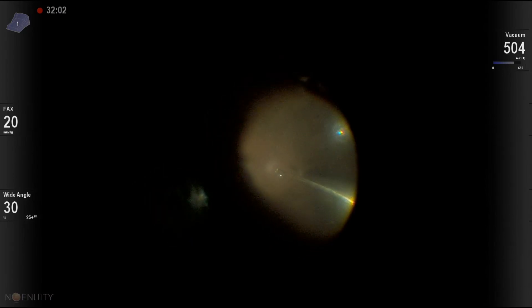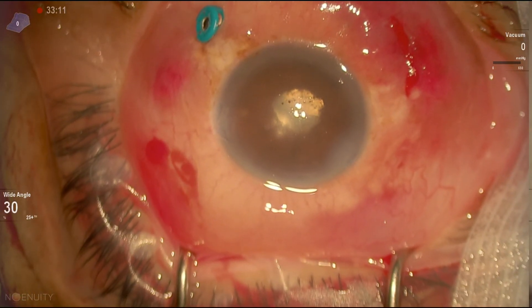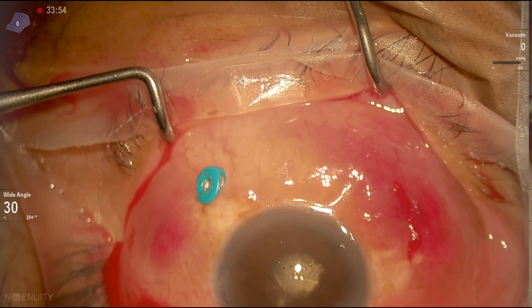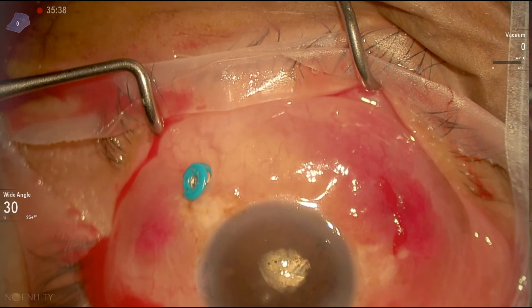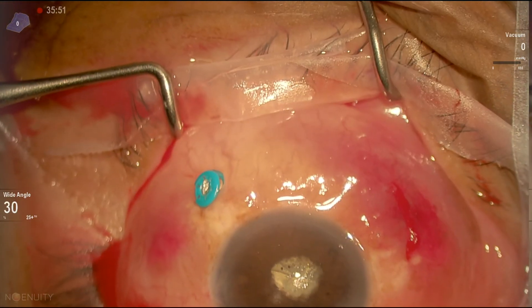So we did this. Now we go back and fill the vitreous cavity with air. That's how we inject the antibiotics — we take the infusion cannula at the end, then inject the antibiotics through the port. That's the vancomycin, followed by the ceftazidime.